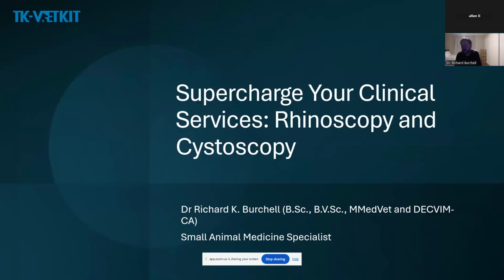Rigid endoscopy is the oldest form of endoscopy, and it predates flexible endoscopy, which we can also use and of which I will illustrate examples. We can use it in rhinoscopy and cystoscopy, depending on your preference.